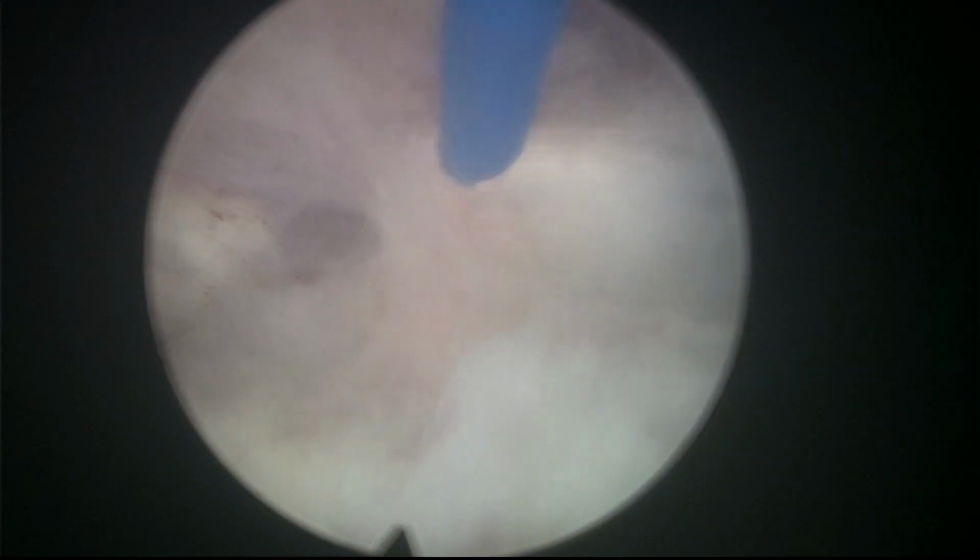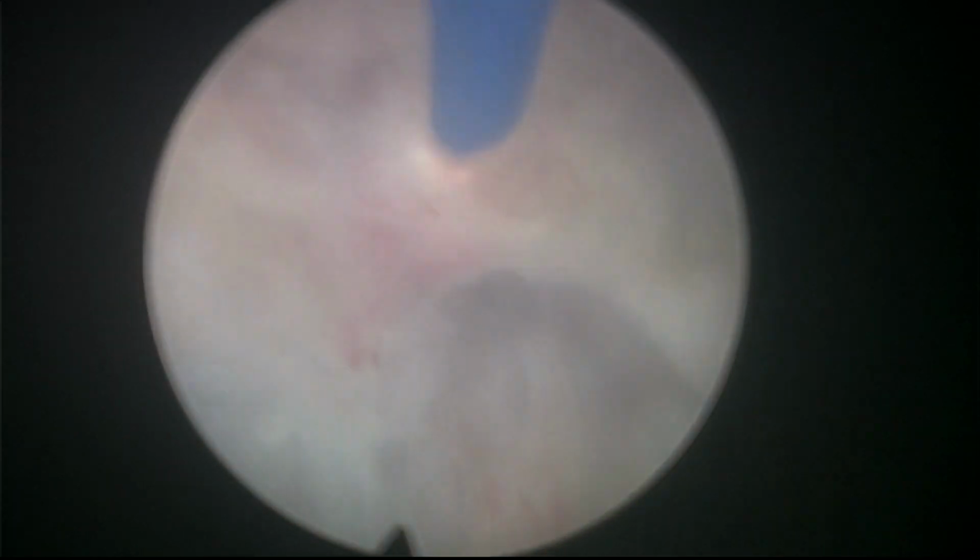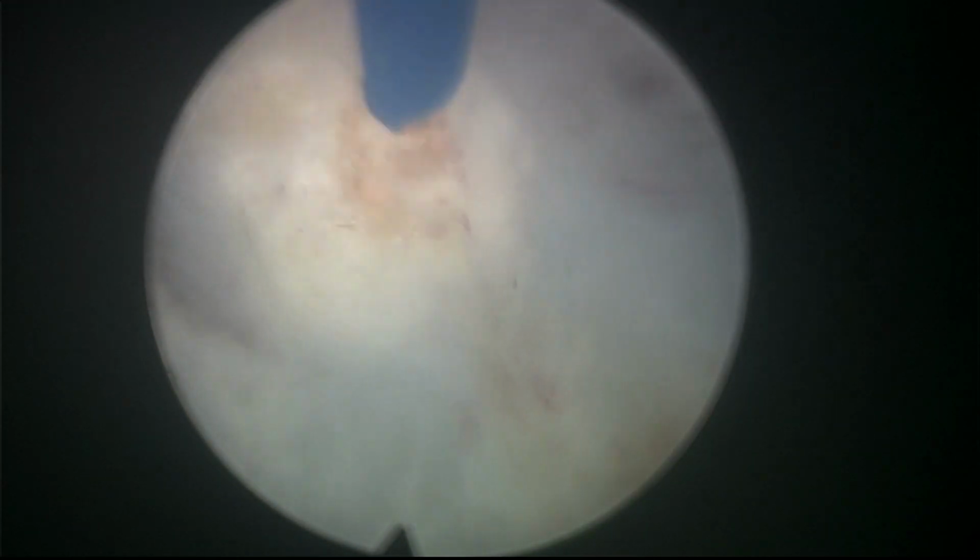But here, as you can see, the chances of leaving uncoagulated tissues is a little bit less. So this gives you the advantage of a nice coagulation. So that's, again, the posterior aspect.